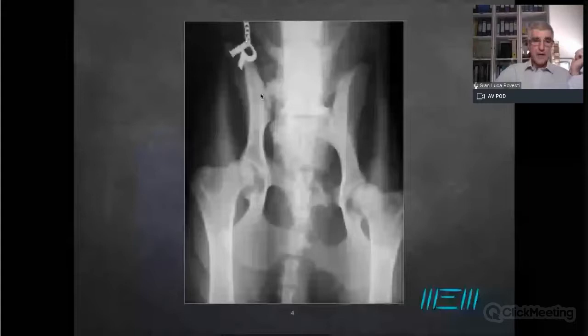In this kind of situation, in most cases, just the thing to insert a screw, for example, a compression screw, can be very dangerous in this area. Also, because if you don't have the option of performing a CT scan in this patient, in most cases, we don't have a precise clue about the fracture that we may have at the sacrum level. So in certain screws in the sacrum, we are uncertain if we have more fracture lines here, can be unsafe, okay?